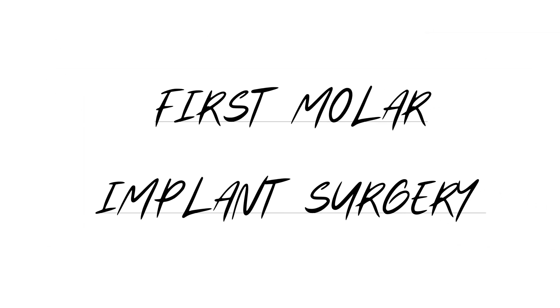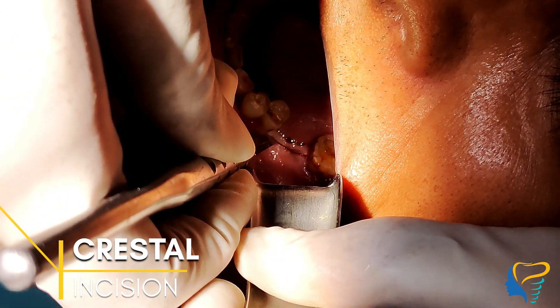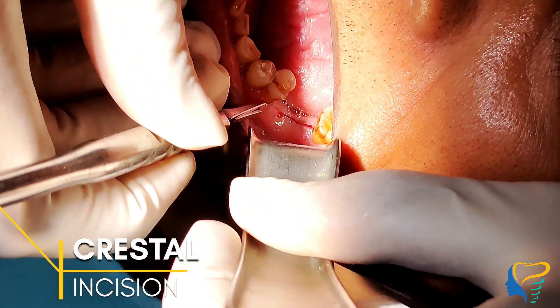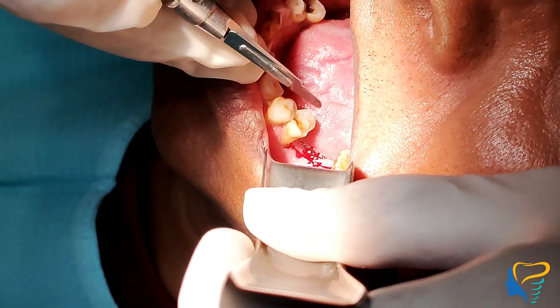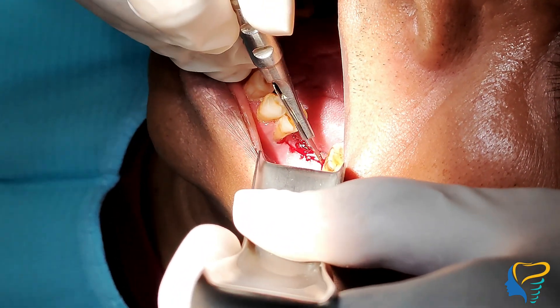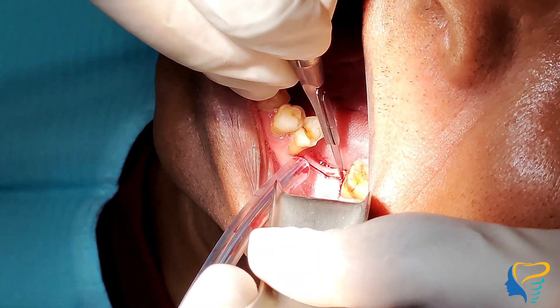Today we are going to see the first molar implant surgery. Starting with the crestal incision, which we are giving using a number 15 blade, with a mild releasing incision on either side.